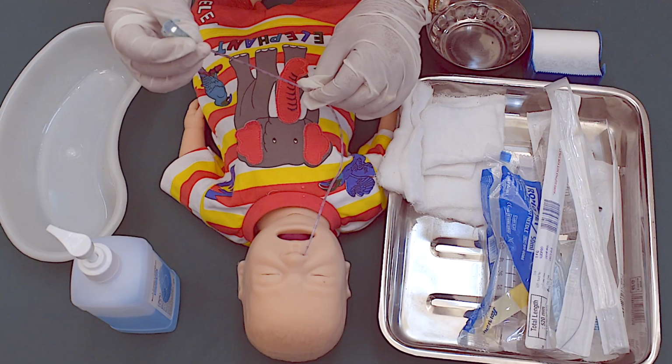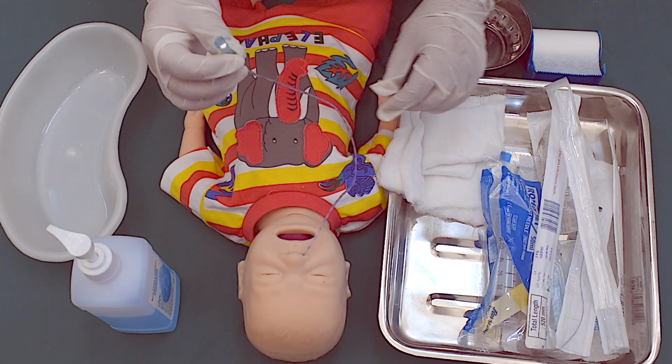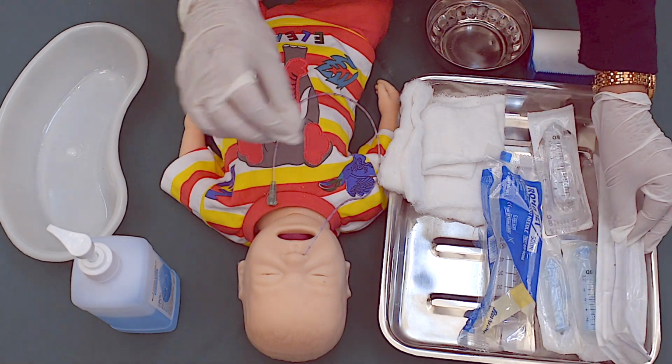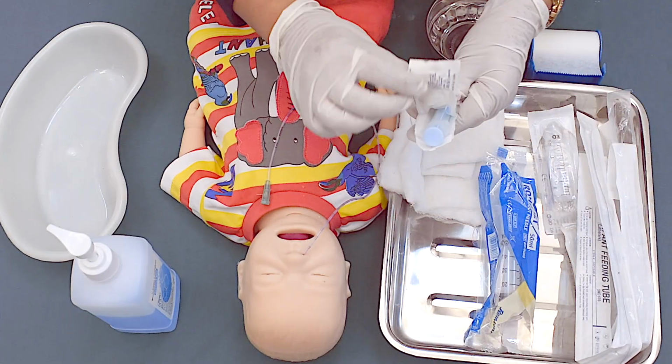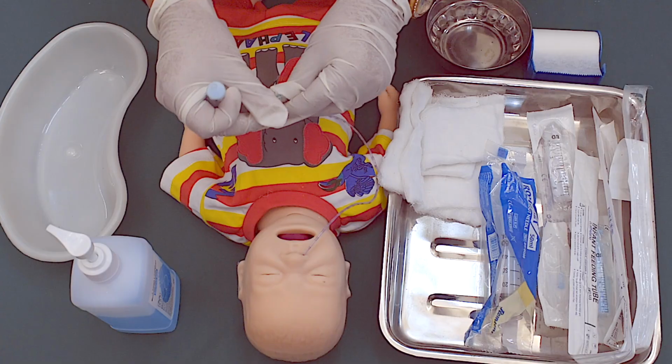There is one more method that we can use to check the placement of the tube. With the help of a syringe, we can aspirate the contents of the stomach.